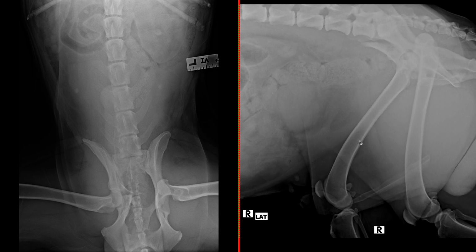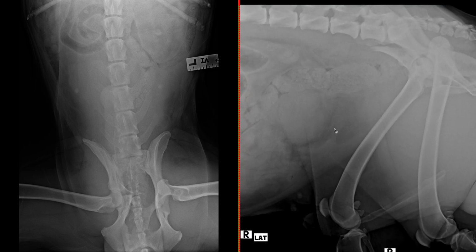Let's take a closer look in the caudal abdomen. We observe a round soft tissue structure that may represent the urinary bladder. It is only partially defined by immediate juxtaposition of fat opacity. Caudal to this, near the pelvic inlet, is another vague soft tissue opacity. This could represent the prostate given the patient's advanced age and intact status. Throughout the region between these two soft tissue structures, there is poor distinction of a possible urethra.